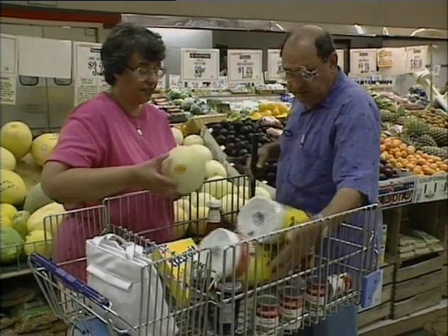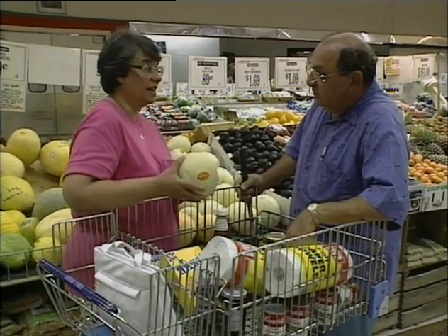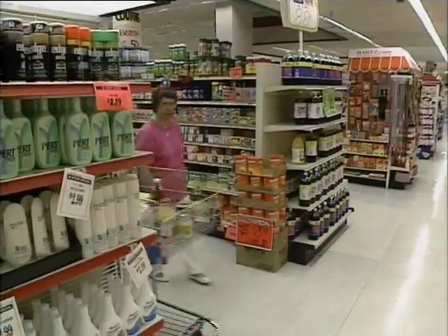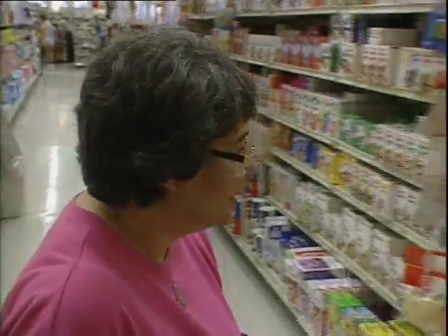We're in Valparaiso, Indiana, and this is Leonard and Lee Pera. Leonard is legally blind. That doesn't mean he can't see at all, but his sight is seriously degraded. This video effect gives a rough idea of what he sees. The sharp central vision is missing, leaving only the less distinct peripheral vision. Leonard has seen the world this way for 10 years.